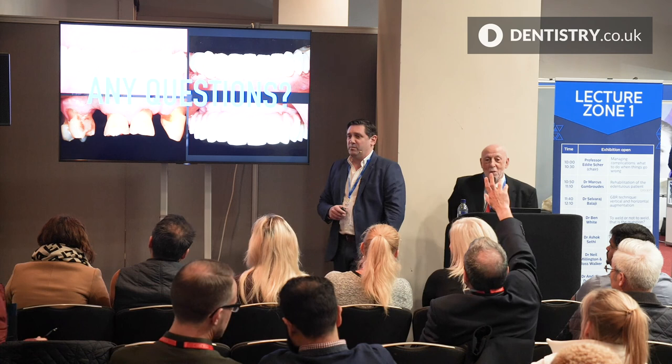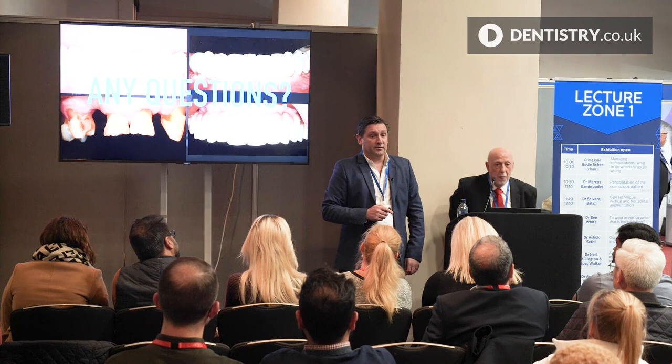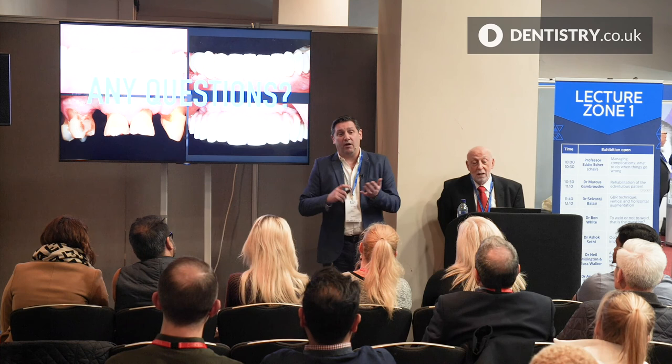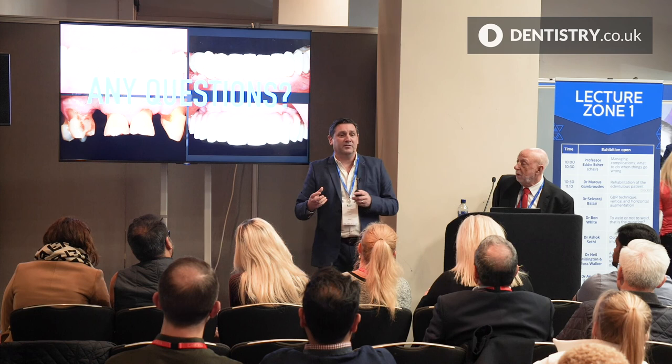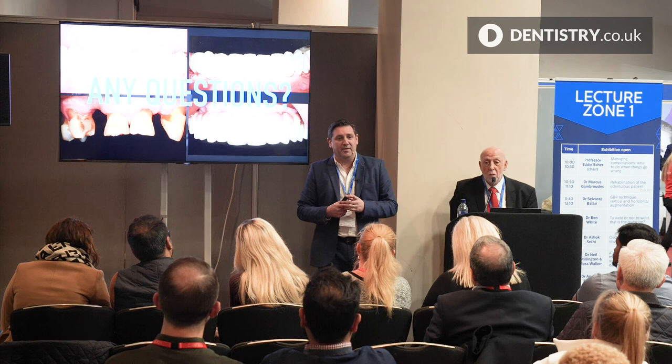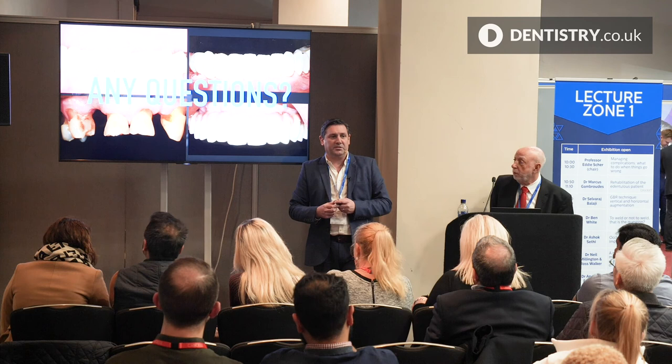How do you take off the crowns? Repeat the question. How do I take off the crowns? Crown and bridge remover. Bang, bang, bang. In most cases, the reason the crown is off is either the temporary cement's gone or they've broken it. So it's not that common that we have to physically remove a crown that's actually intact and in place with cement, because usually you're removing the crown because either they've broken something or it's decemented. Occasionally you get patients continually knocking it off, in which case I might cement it back in with a permanent restoration.